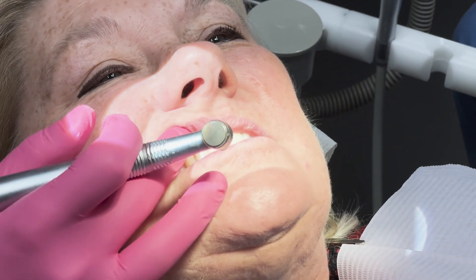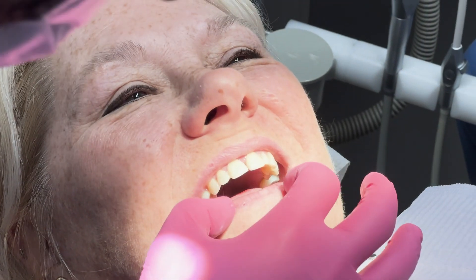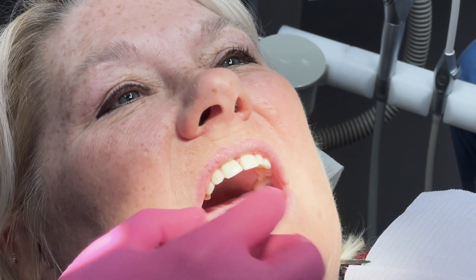Okay, I'm gonna try that. So it is going to be new - it's going to feel a little different, just having it in there. Feels different. Feels good? Yeah. Alright. And open, bite together, and open. Let me see this back tooth that we did. How's the bite feeling now with these new front teeth in?